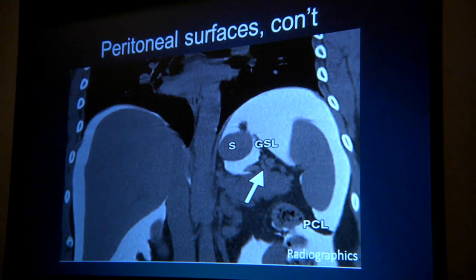I don't know if this is an incident report. I got this out of the literature. Would a person put contrast material into a peritoneal dialysis catheter? Some nurse could tell me. Well, that's what happened here.